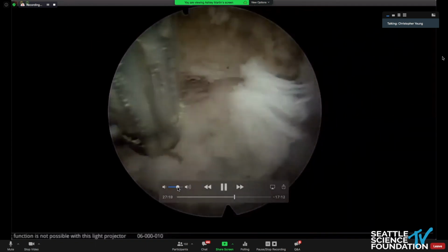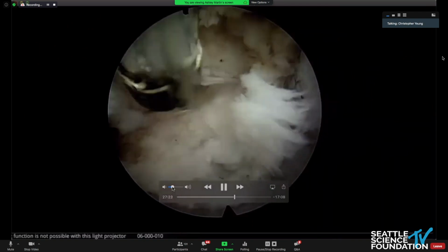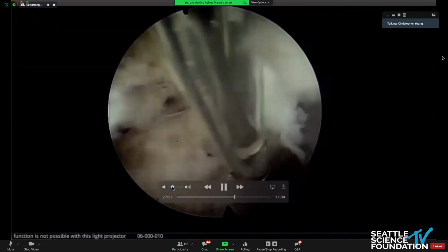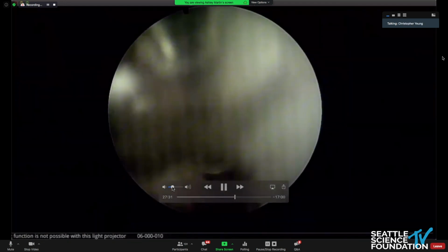Okay. So I just looked at that. I wasn't so concerned about that one because it was more the root compressed in this gentleman, but I was just trying to show the anatomy that you can see.